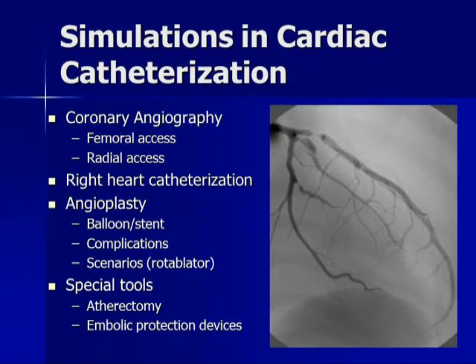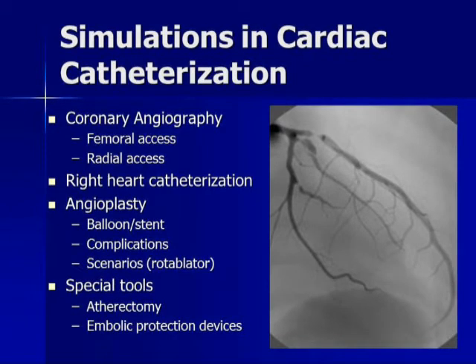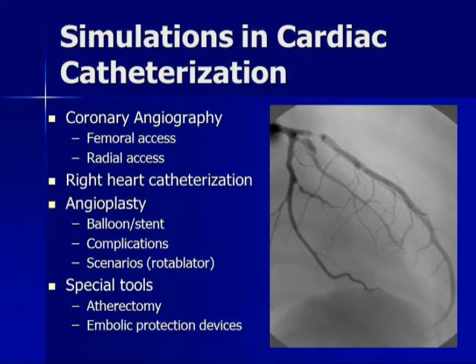And then specialty tools. We've got a huge number of new tools. The route to FDA approval in the United States, you would be surprised at. If you have a device that is similar to something else, that device goes through 510K approval, which means it needs to be used in 100 to 150 patients to show somewhat similar safety to a previously approved device. That's how many of our products are used. So when you're getting it as a patient, it may have never been used in more than 200 people in the United States. With that, there are training issues that go with novel device use, and then complications magically occur in the community where they gain experience with that.